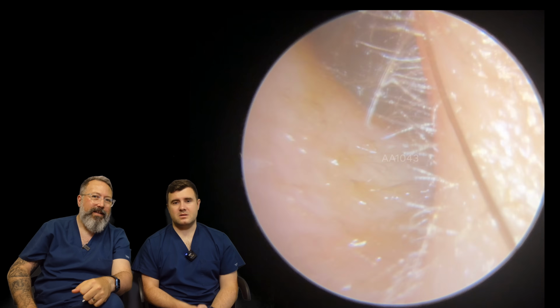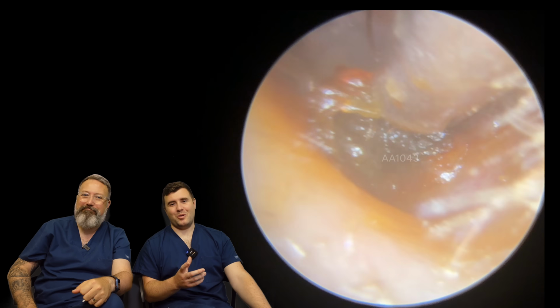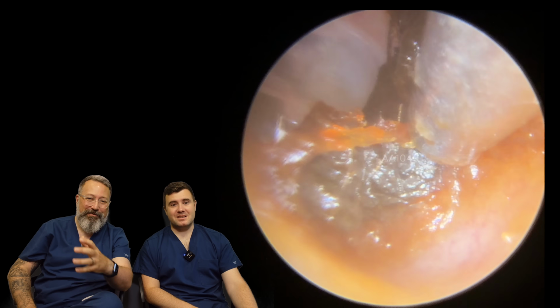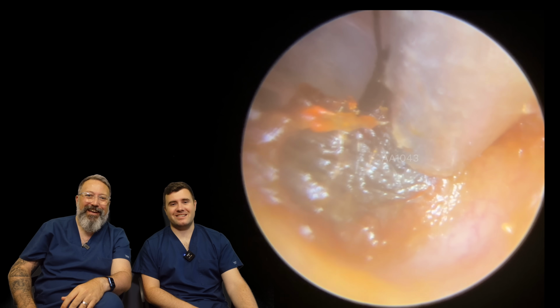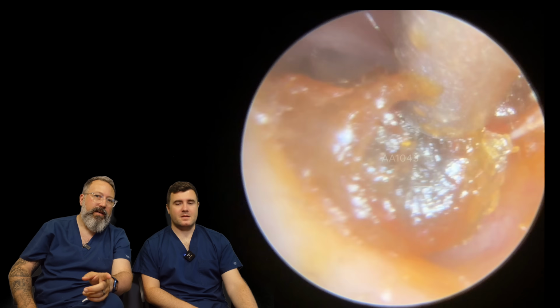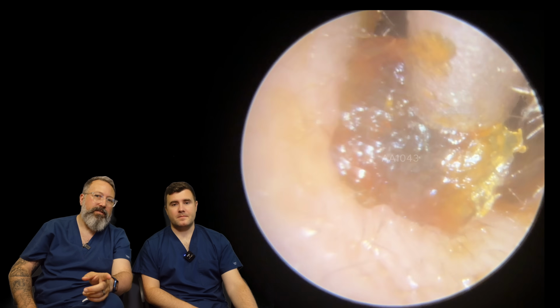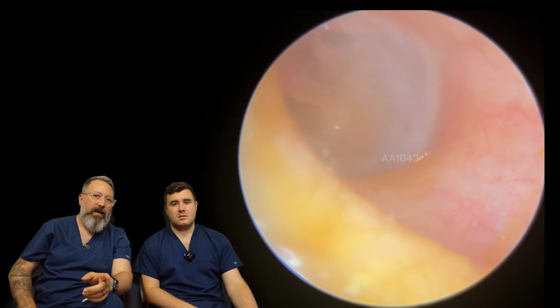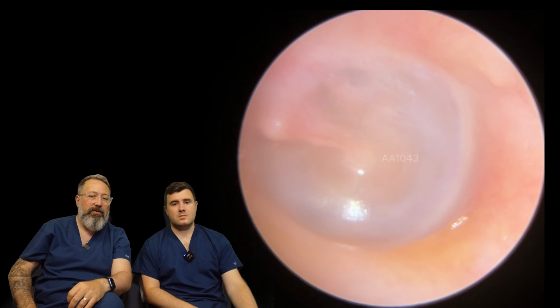It's always typical. These ones are not normally the problem, but usually take the longest. It's always the ear canal they didn't come in with an issue. It's always the one that takes the longest amount of time to get it out. But there we go, we've got the detachment there now. We're just pulling from the sides, and out that comes, all the way out. And then eardrum looking absolutely spot on on this side as well.